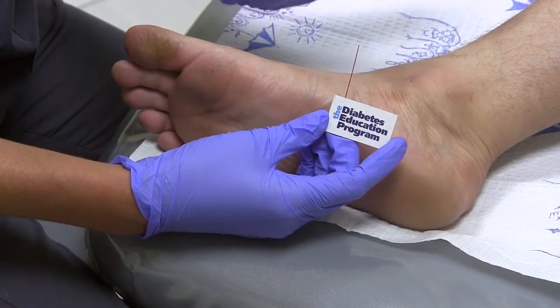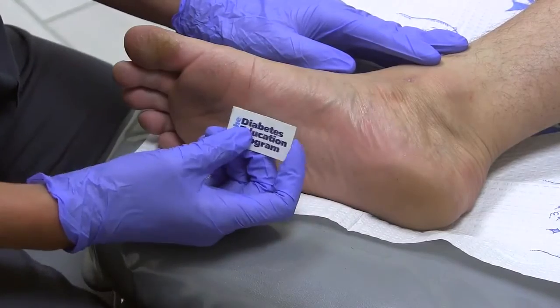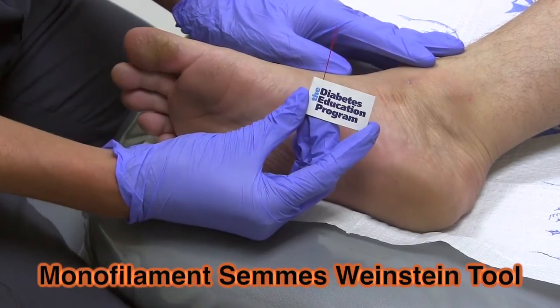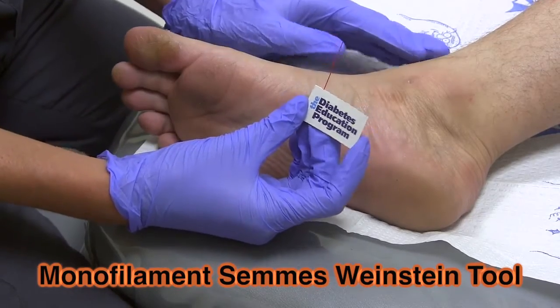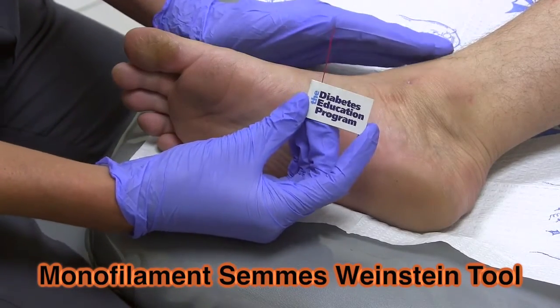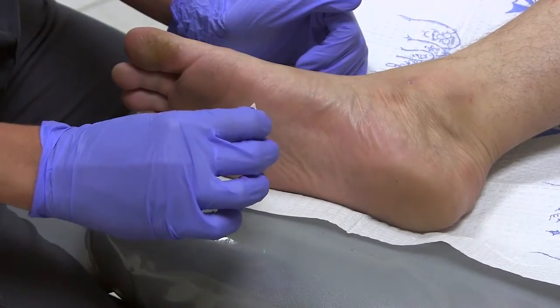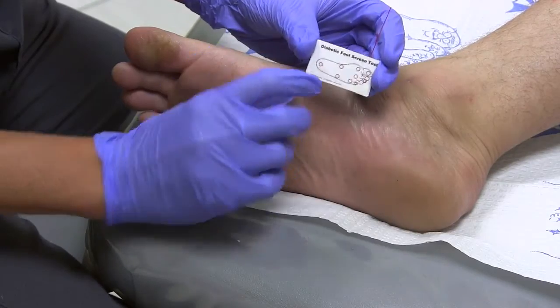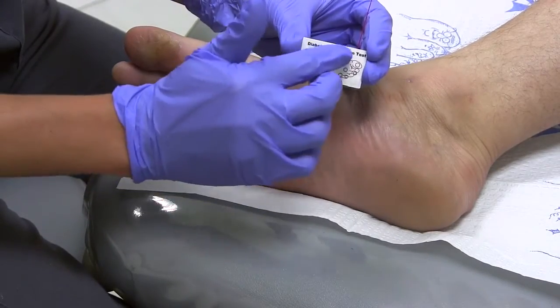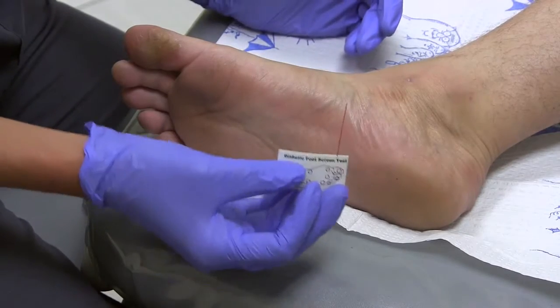Today we are going to assess Jonathan, who is a new diabetic patient, on his sensation in his foot using a monofilament Semmes-Weinstein tool. You have to ask your patient to close their eyes and let you know when they feel it when you press the filament on their skin. You can reference on the back side of the tool on different spots, or you can just go all over the foot and assess it that way.